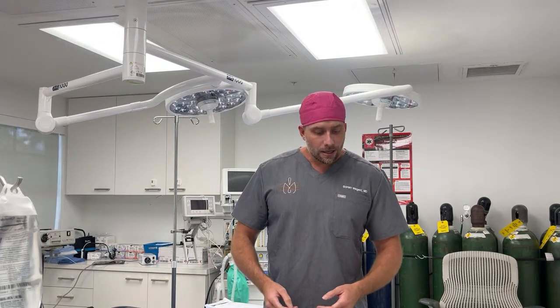But with how implants are designed now, our latest generation of implants, they have this highly cohesive gel. They don't ripple nearly as much as they used to. They're really a quality implant, and with our different techniques for placing implants, we really don't need those shaped implants to get a great natural looking result with breast augmentation. So by and large, I use silicone implants. I think they feel more natural, they look more natural, they have less rippling, and frankly, I think they're probably going to last longer than saline implants. So most of my patients, I guide them to silicone implants. If anyone has an extreme aversion to silicone implants, we do offer saline, but most of my patients get silicone implants.